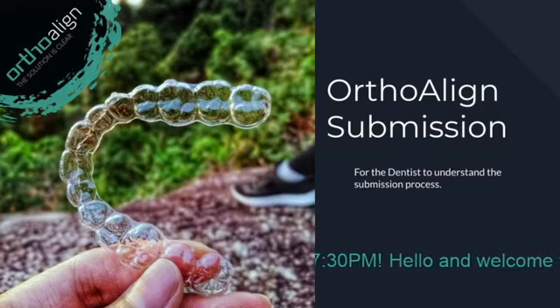The third thing is going to be the RX form, or we also call it a lab form. And then the fourth thing is we're going to need an intra-oral scan or an impression of the patient's upper and lower arch. Okay, so these are the bare minimum.